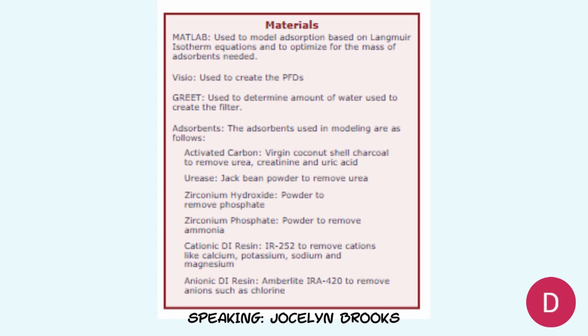Next, we used two different zirconiums. First is zirconium hydroxide in order to remove the phosphate. And then finally, the zirconium phosphate, also in a powder, to remove the ammonia created during the reaction of urease and urea.